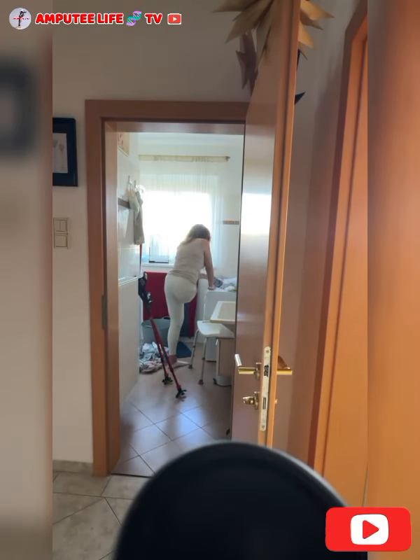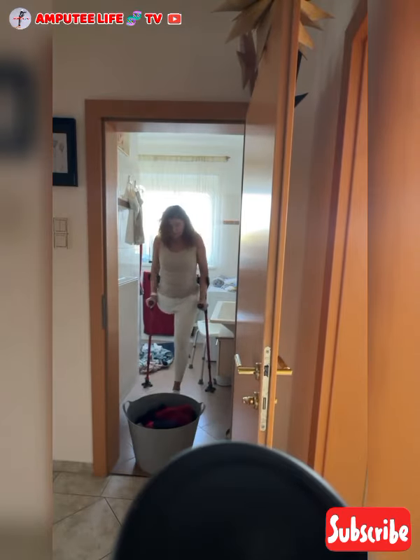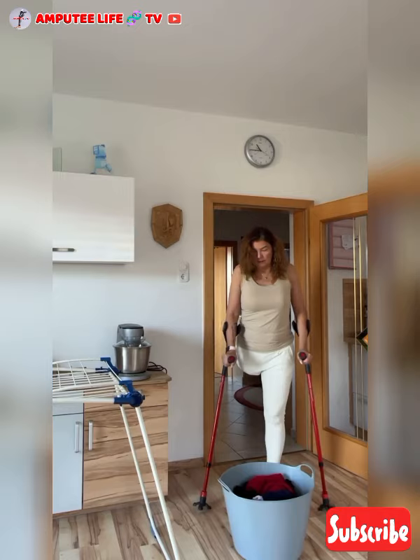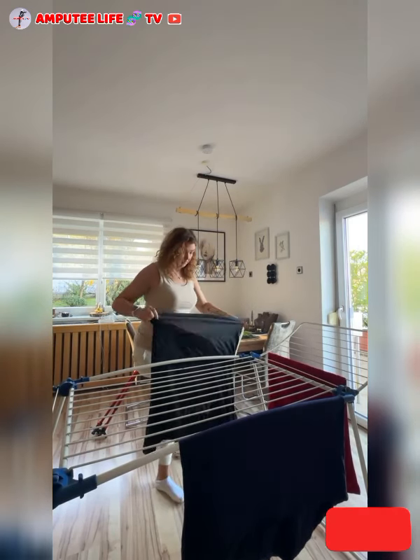With the aid of forearm crutches, which are a valuable mobility aid for individuals needing additional support while walking or carrying out tasks like house chores, the ergonomic design offers improved comfort and mobility to navigate. An individual with limb amputation can enjoy enhanced stability and independence.